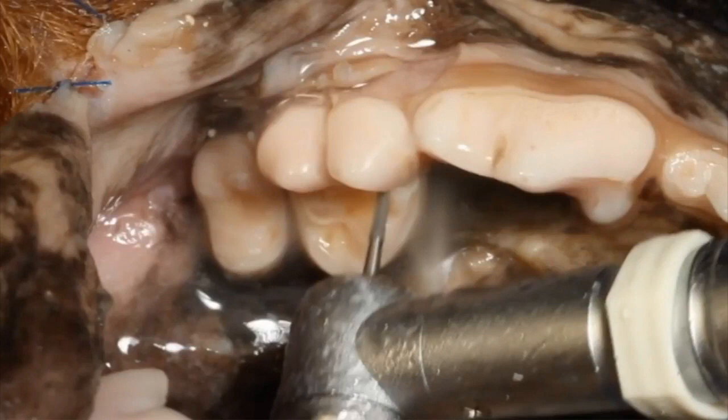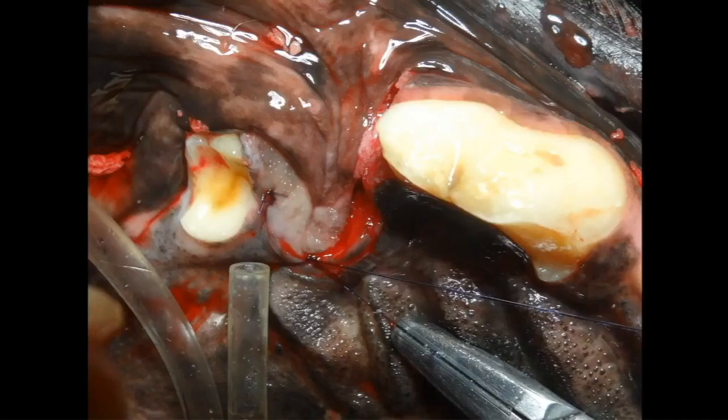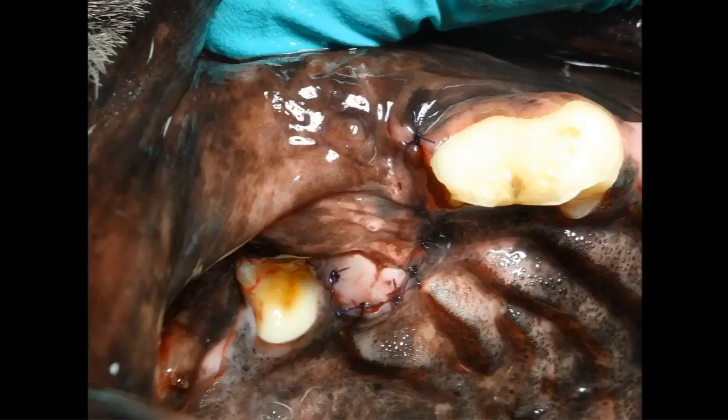We also pretty much maintain that position when we're doing our luxation and elevation. And then when we close, we're in that same orientation where literally the crown of that fourth premolar is pointing right at us, the palate's pointing right at us, so we have really good visualization to close the extraction site.